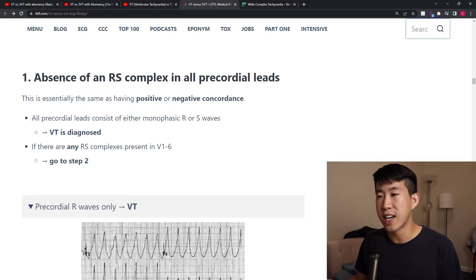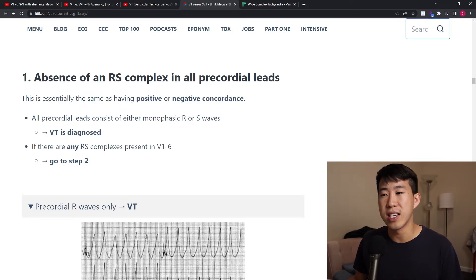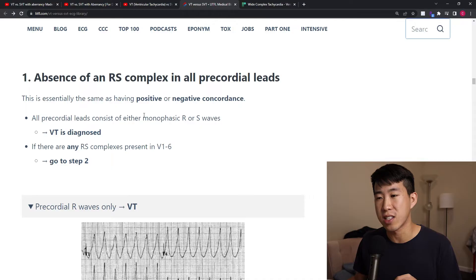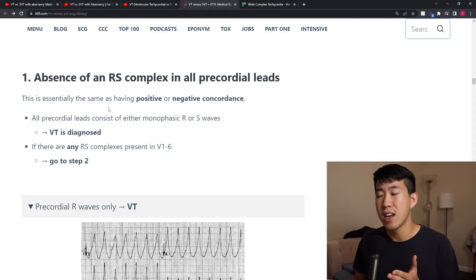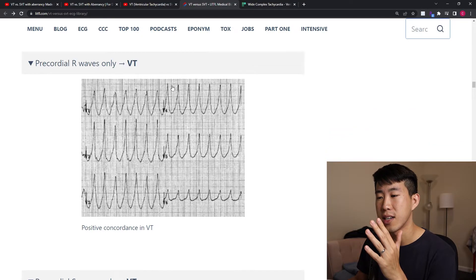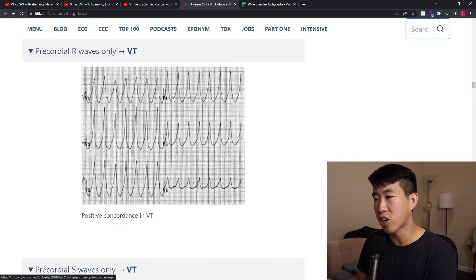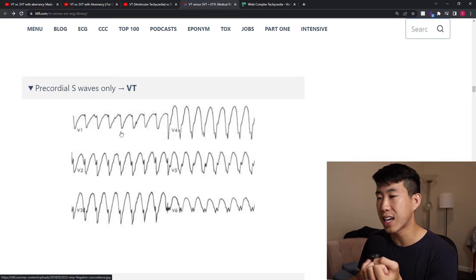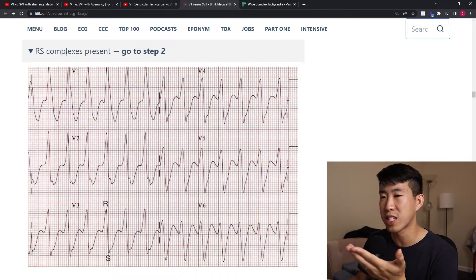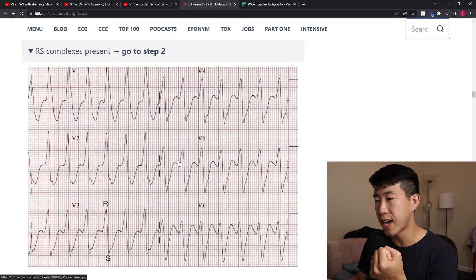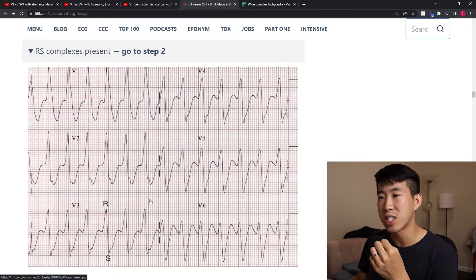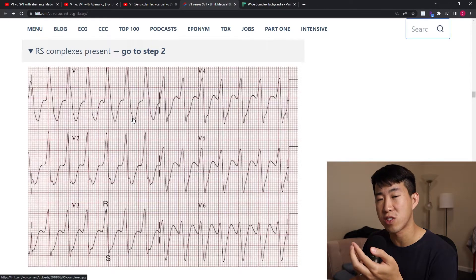Step one of the Brugada criteria is the absence of an RS complex in all precordial leads — essentially, does the patient have positive or negative concordance? If there is positive or negative concordance, you can immediately diagnose VT. Here we have only an R complex — positive concordance. Here we have only a negative S wave — negative concordance. Whereas in this example, RS complexes are present with both an R wave and an S wave, so we can't diagnose VT right away and need to go to step two.